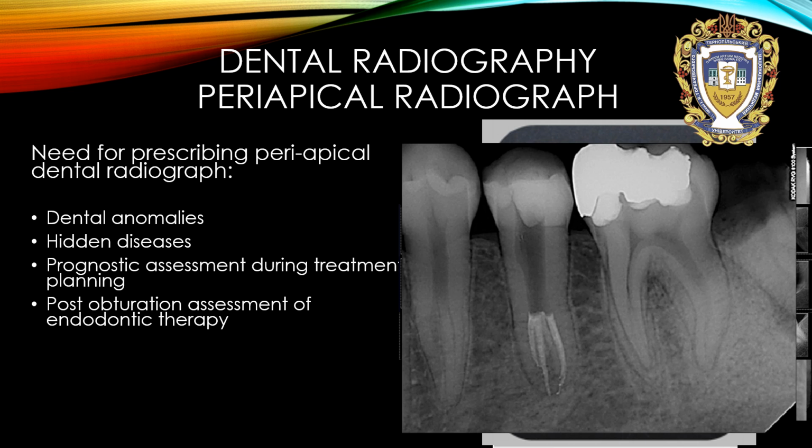Of course, this work was done under a microscope. You cannot do this treatment only manually. Moreover, I think it is a specific patient because previously the tooth had 1, 2, 3 root canals minimum. Like the next tooth, where 1 root canal is divided into 2 root canals.